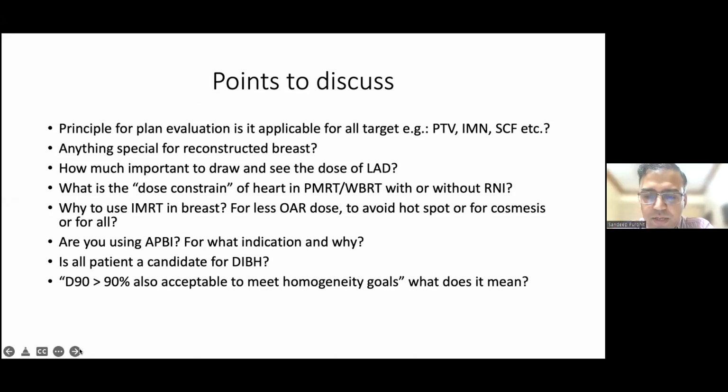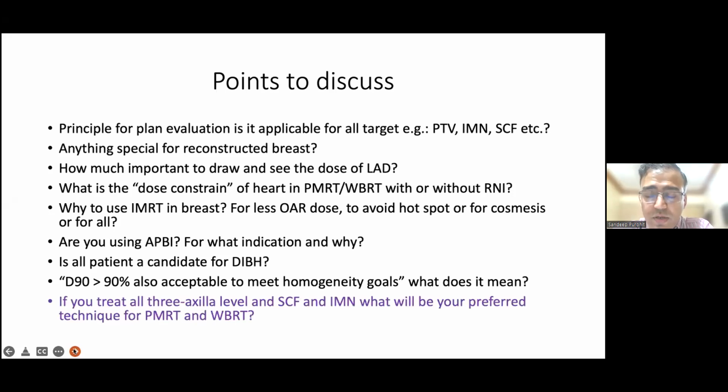So what I mean by that is, if the dose received by 90% of the volume is 90% of the dose, and it is homogeneous, with no cold spots and no hot spots, and if it varies between 95 to 105. A few spots may include 90% of the dose, but most of it should lie between 95 to 105.